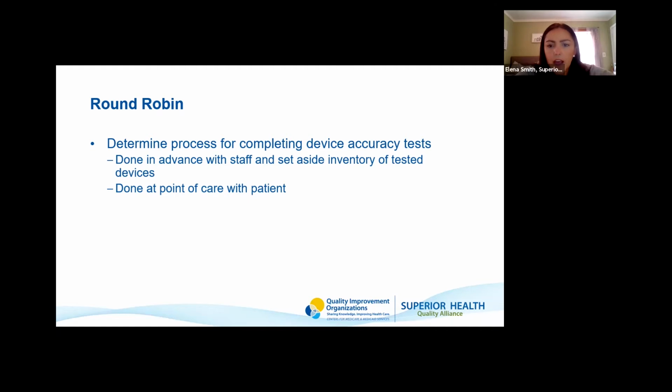The next question we asked was about that list, and when they think more devices would be added. Basically they said it's ongoing. What has to happen is the manufacturers of the devices need to submit to be listed. So that could mean that, like Medline, it is clinically validated, they're just not on that list quite yet. And whoever ordered those devices, if they have a relationship with them, they could mention that that's something that would be important to you.